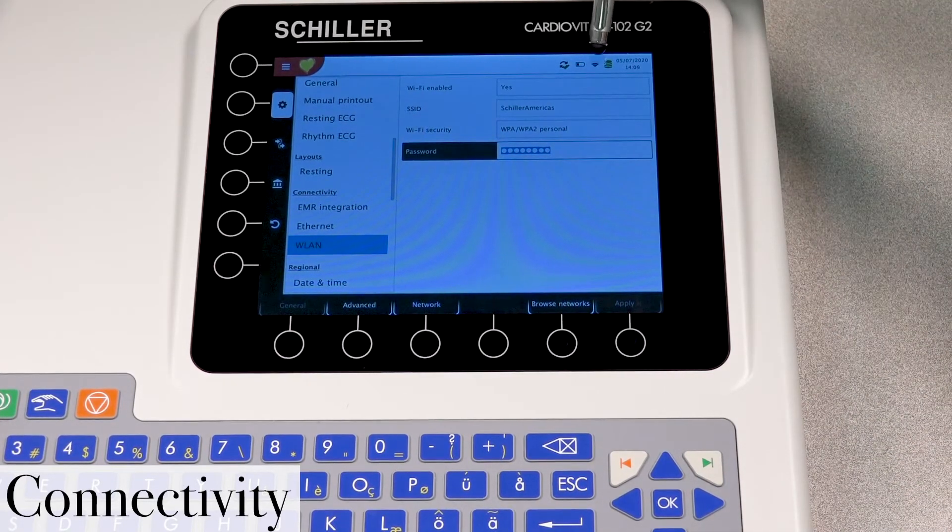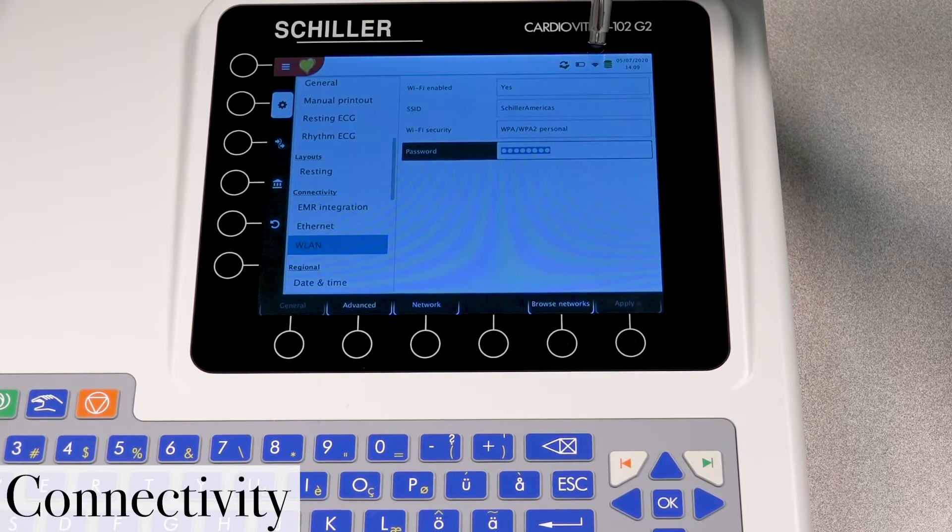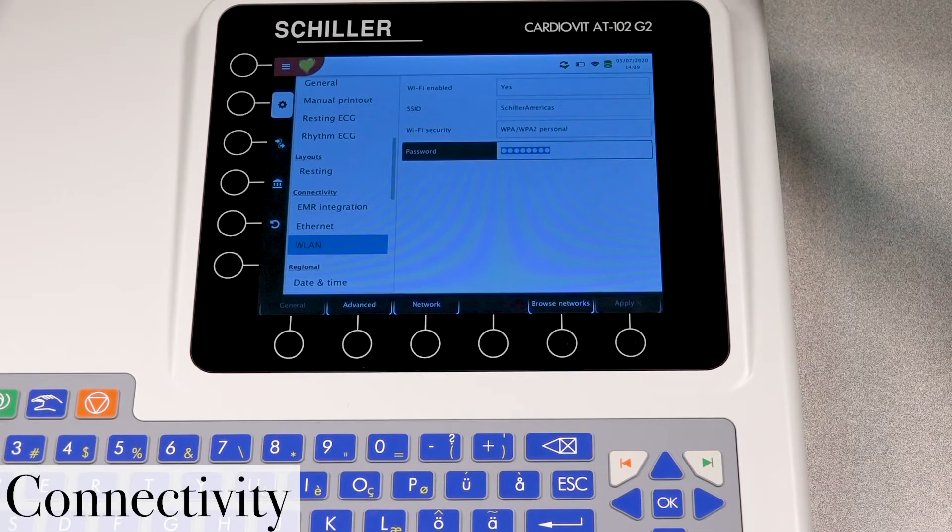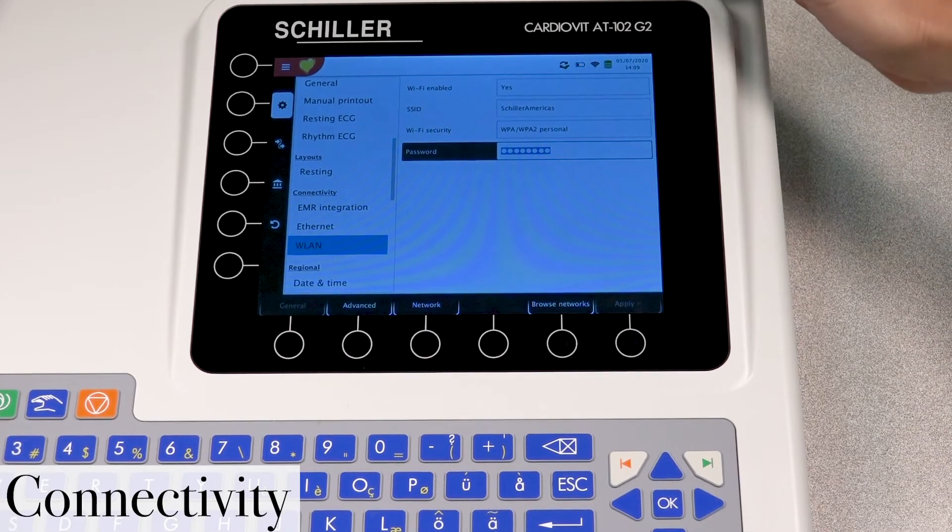Now take a look here at the top. You no longer have an X, you actually now have a black Wi-Fi icon. Now that black Wi-Fi icon indicates that you are now connected to the Wi-Fi network.